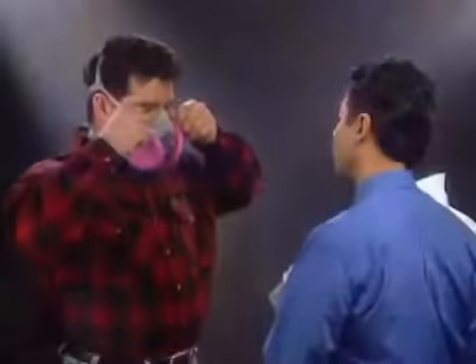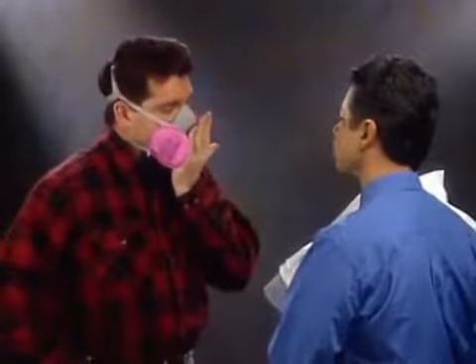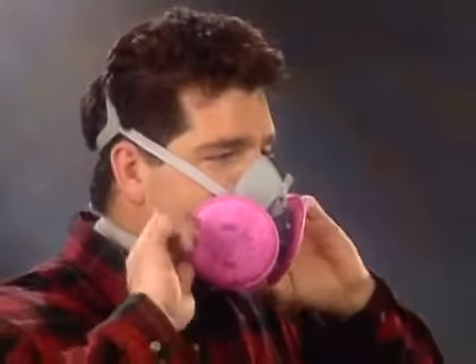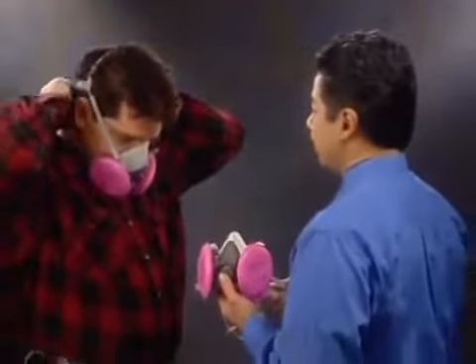The particulate filters are used so that only facepiece fit is tested. The qualitative fit test must be repeated at least once a year to ensure that your respirator continues to fit properly. If your respirator doesn't fit well enough to pass this test, you'll need to refit your existing respirator or try a different size or style of respirator until you pass the test.